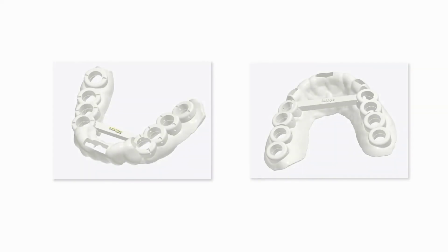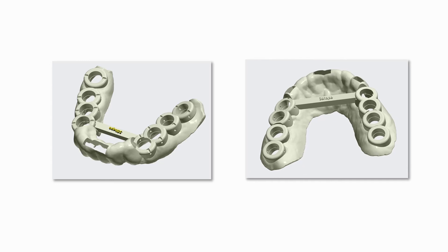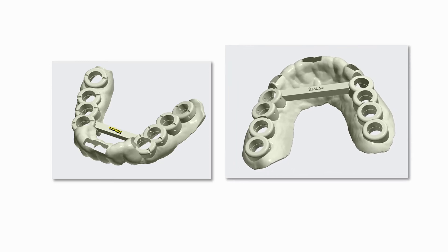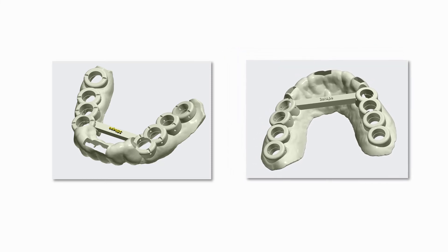If possible, stabilize the guide by adding bars from tooth-supported to free-end areas. However, remember to design the bars in such a way that the tongue can fit without any discomfort for the patient. For the upper jaw, it is possible to position a bar going from one side of the jaw to the other, which also works as a handle.